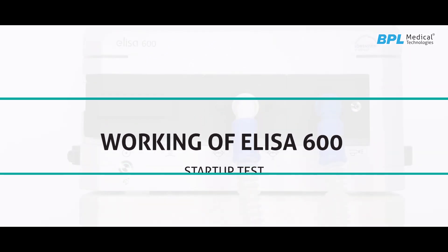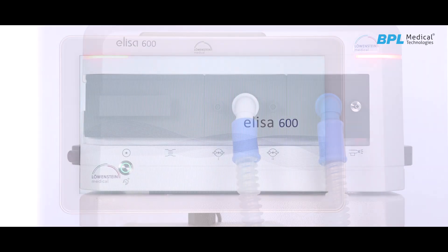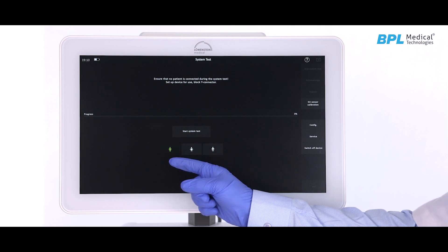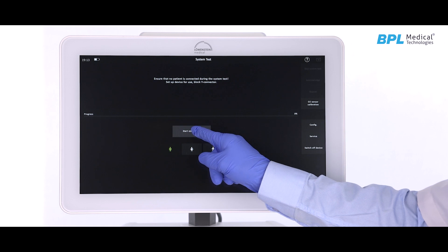For startup, press the master control switch to switch on the device. The unit will boot up with a power test and will ask you to select between adult, neonatal and pediatric patient category.